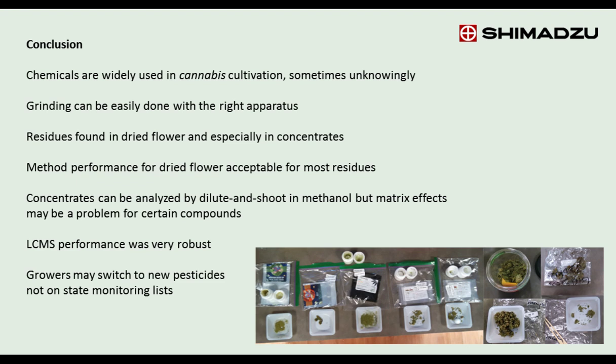Well, that's a good question. In the cannabis industry, there's strong pressure to use smaller samples because the product is very valuable. But on the other hand, we have to make sure that the sample is representative. And so typically what the states require is that a sample collector represents the lab and collects a sample in a statistically sound sampling procedure. And usually that means going to a production lot and selecting a small subsample from a randomly assigned part of the batch. So if we had a 15-pound batch, the collector will select a small sample from several different places throughout the batch to ensure that a representative sample is selected.